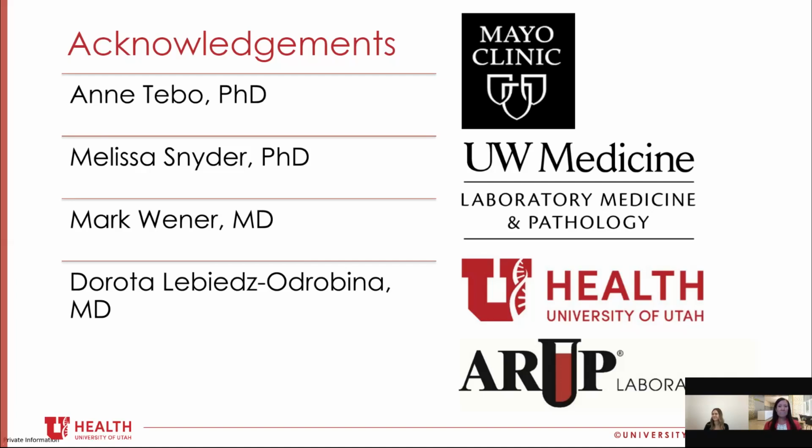Great, thank you. All right, I have another question here. We currently perform the Werfen SM and SM RNP ELISA tests and report these results together. A comment is also put that states, when interpreting the SM RNP result, you should take into consideration the SM only result. Is this sufficient? Or should we also perform the U1 RNP test?